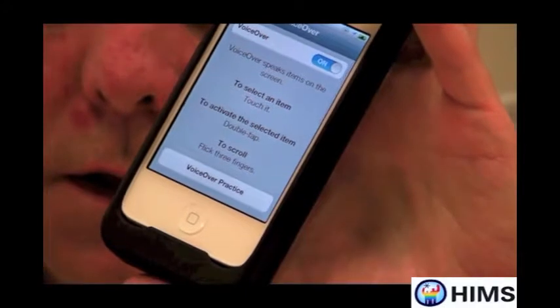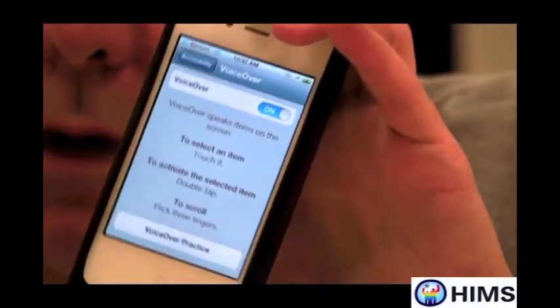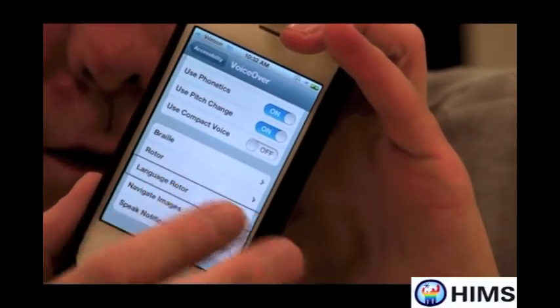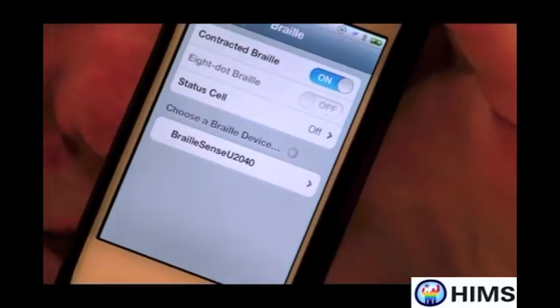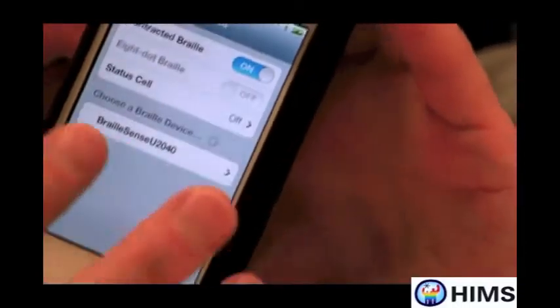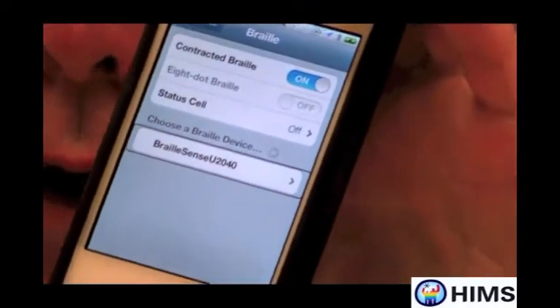Inside VoiceOver settings, we need to find something called Braille, which happens to be near the bottom of the screen. So I'm going to take my four fingers to the very bottom of the screen and flick left several times. I now found the Braille button. I'm going to double tap on it. And what's really neat here is I've already made the BrailleSense U2 a discoverable item, so on my screen I should find the BrailleSense U2. And indeed it said 'BrailleSense U2 2040,' referring to the 40-cell U2 Braille display.